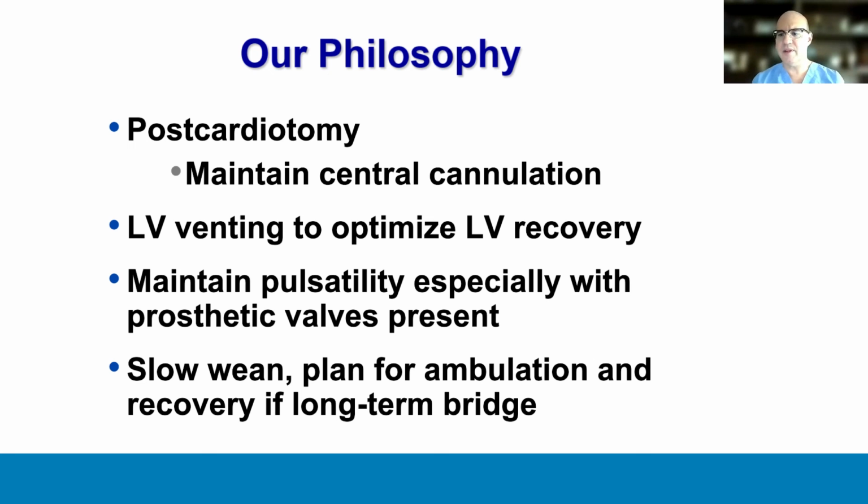Sometimes the investment up front means long-term gain. So plan for, if you want chest closure, even if you're centrally cannulated, plan for ambulation and recovery. But if it's a long-term bridge, some of these newer innovative cannulation strategies work very well and allow you to close the chest.